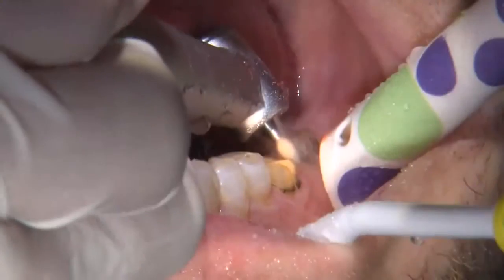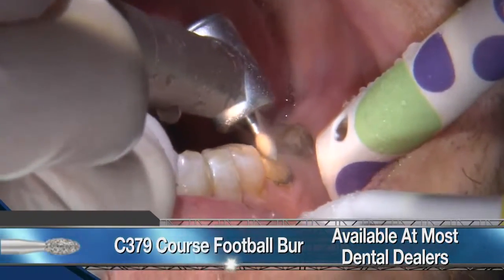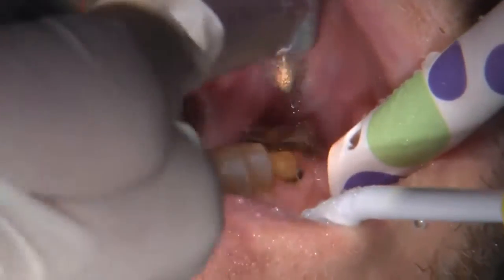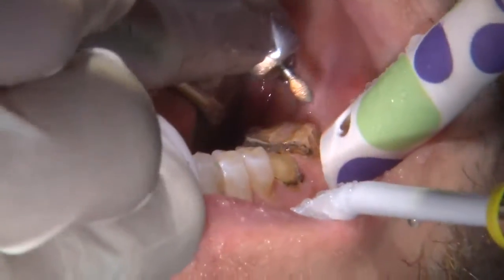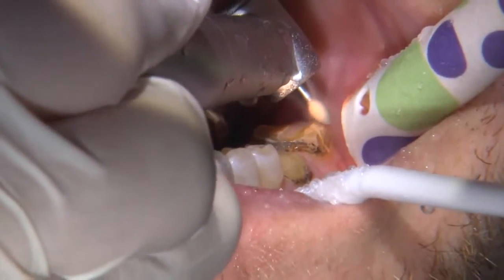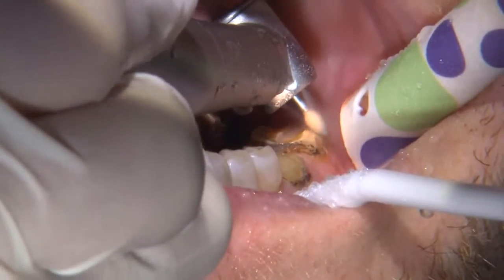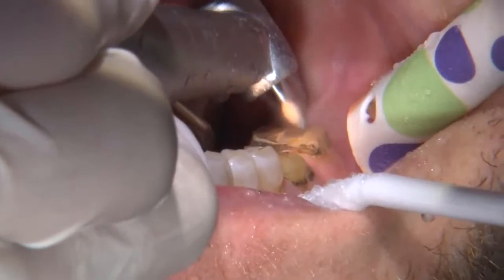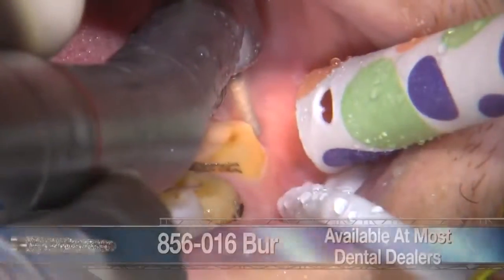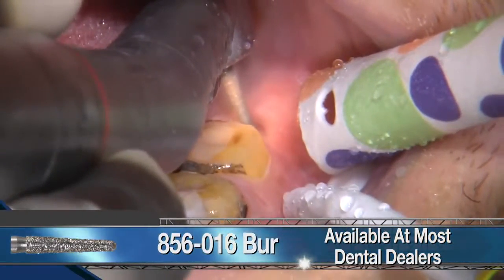the axial walls. Here I'm using a coarse football to reduce the occlusal surface. We are using an all-ceramic restoration for this case, so ideal reduction occlusally is 1.5 to 2 millimeters, and I do use a prep check guide that shows me what areas need to be reduced even further. Even though PFMs were placed previously, there was still a lack of reduction. So I do most of my gross reduction with a coarse, round-ended tapered diamond.